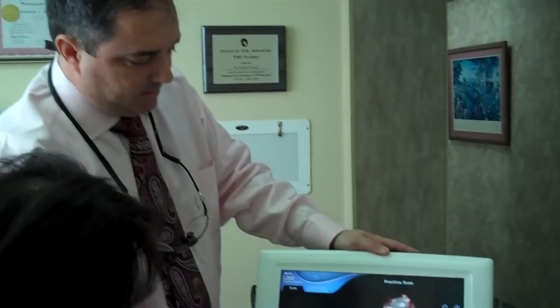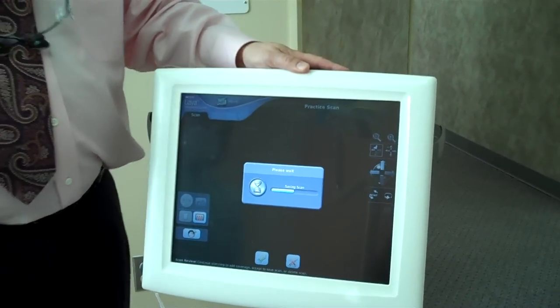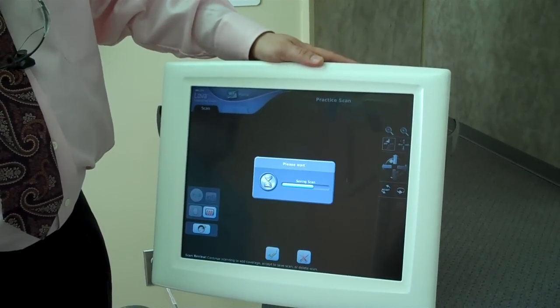into one 3D image that's accurate to as little as 20 microns, which is really, really accurate compared to our old impressions, which were accurate up to 60 microns. So right now the computer is stitching all that together. We get an image, and it saves the image in the computer. And then it will pop it back up for us in a second.